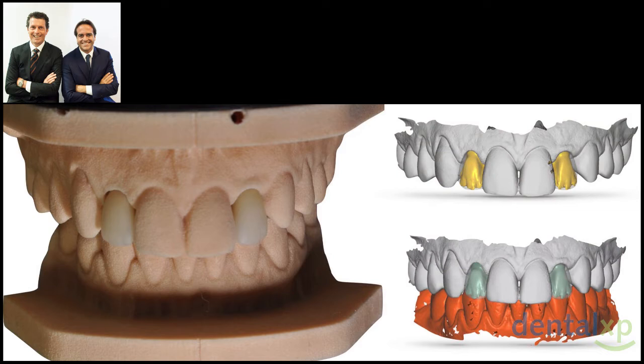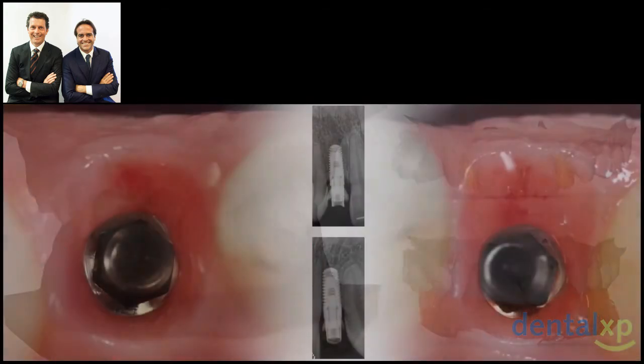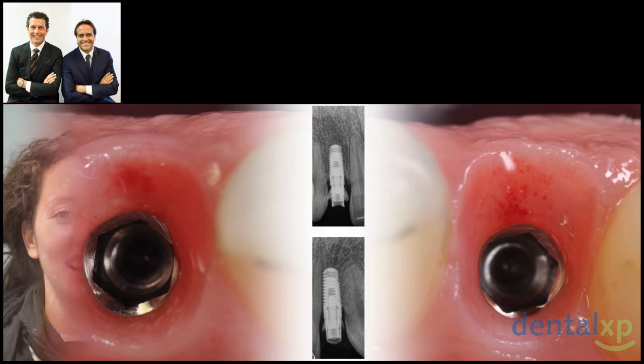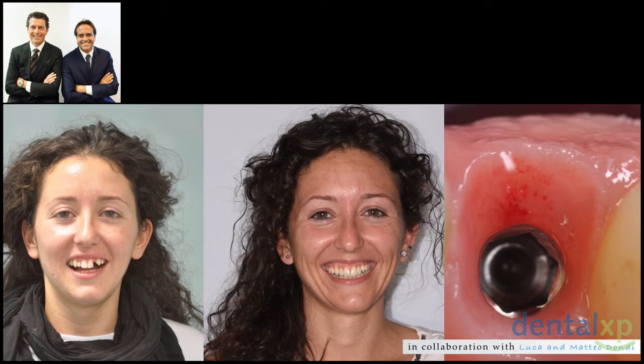Here you can see the digital model, which was then produced after the data elaboration in the CAD software by the lab technician. In this case, if we compare it with the previous one where we didn't utilize the model, it is important because the dental technician needs a position to layer the ceramic on top of this zirconia framework to optimize the overall aesthetic of the case. But the overall aesthetic of the case is probably optimized by this pink tooth, by these pink frames, because we will see that the pink is always optimizing the white tooth form created by our dental technicians. And here we have the before and after of this patient, and you can see how the smile was improved by the management of the two lateral incisors, and how challenging this case was aesthetically speaking.